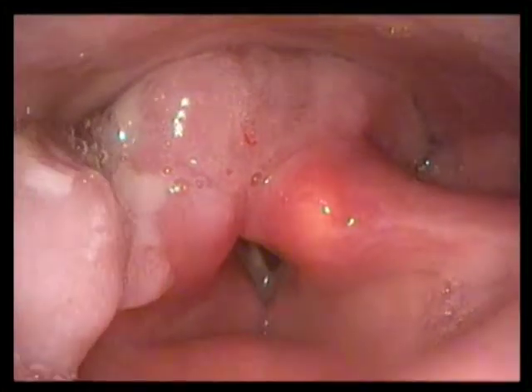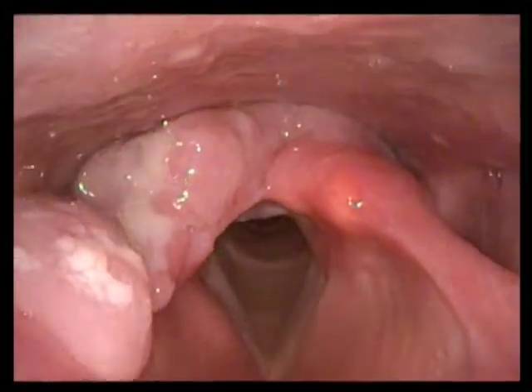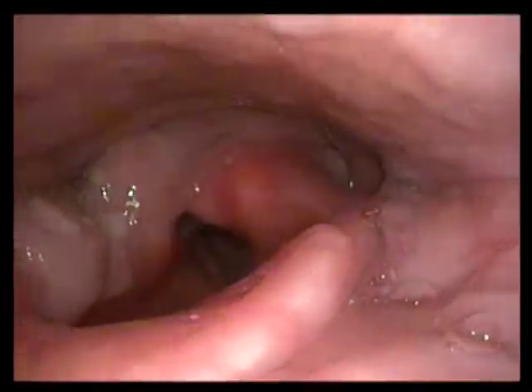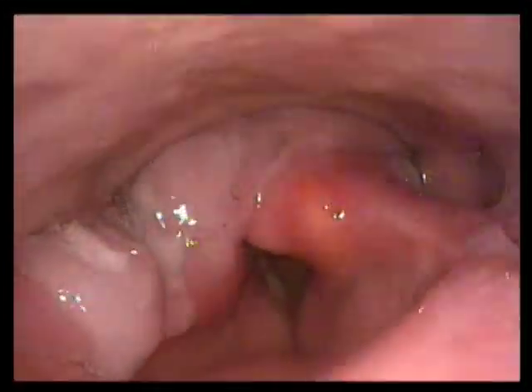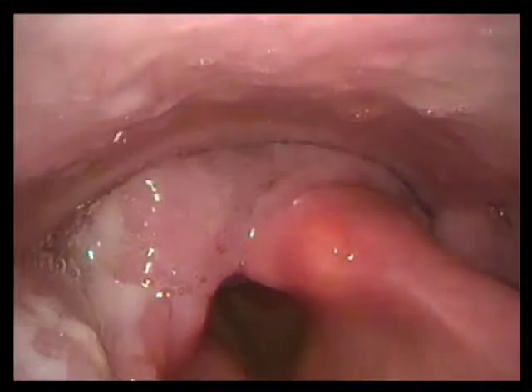In this case, we see a patient with a right aryepiglottic fold cancer. We test for function of the vocal cords by having the patient vocalize E.